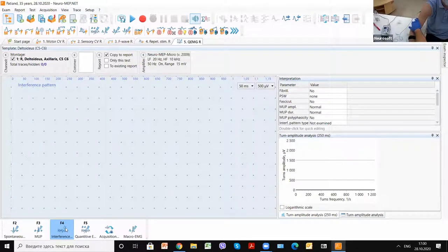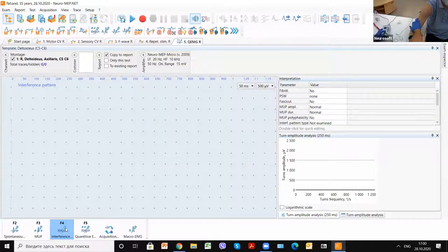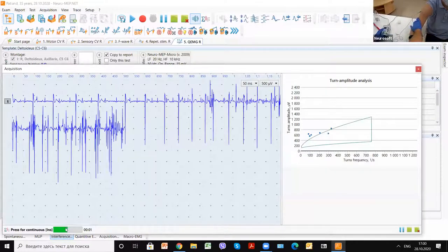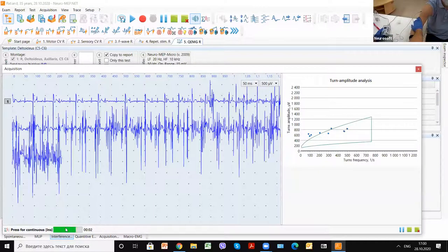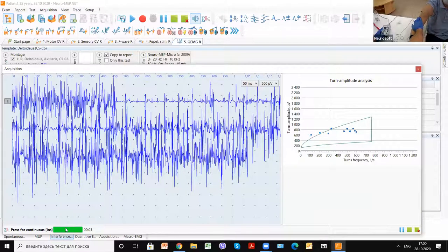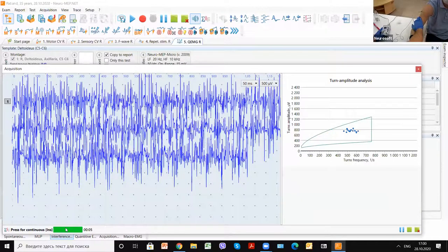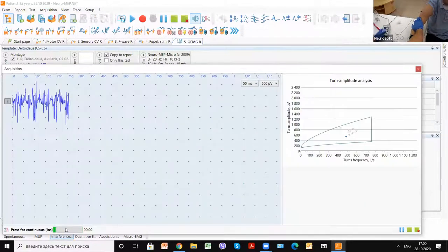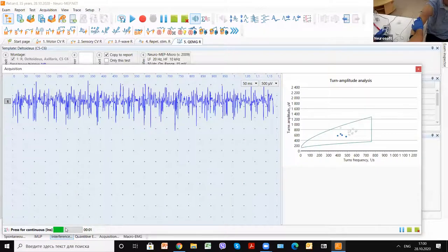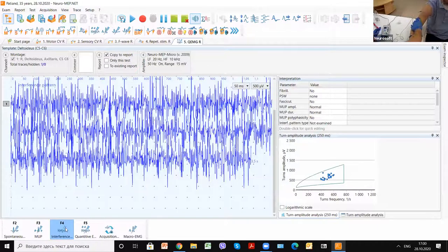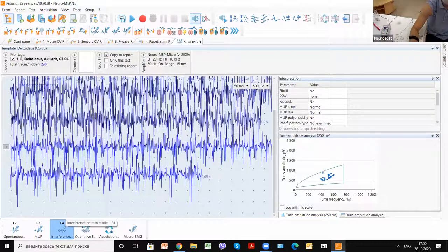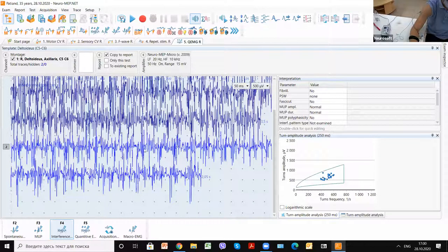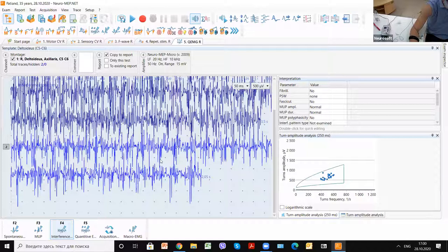So please tense maximally as you can. You can see we analyze interference pattern with maximal contraction of the muscle.